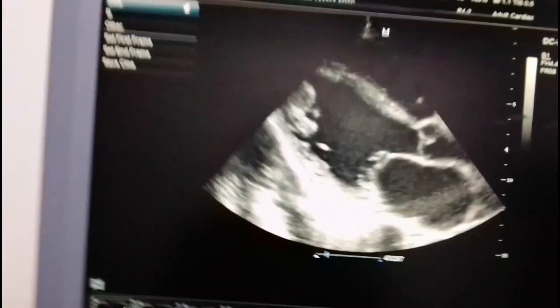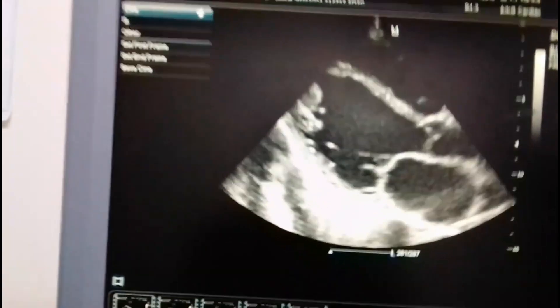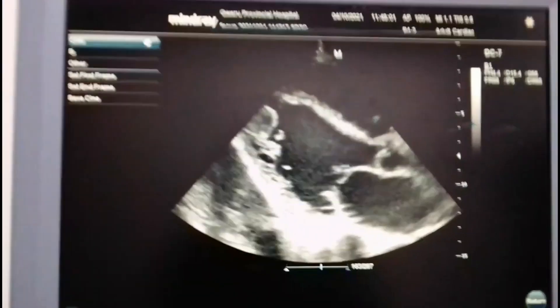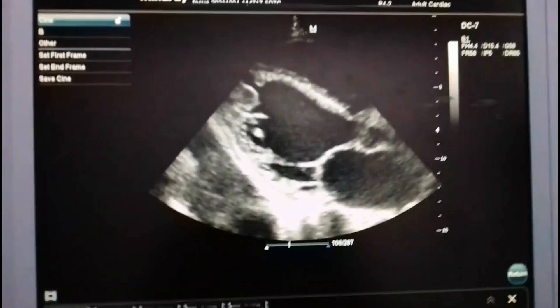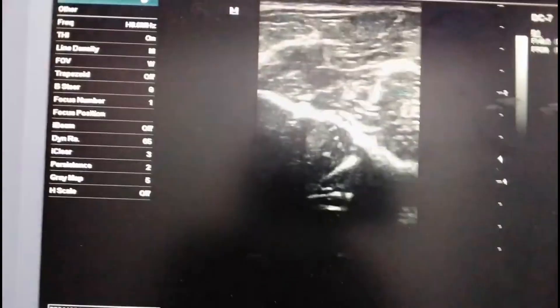Let us do a practical demonstration of how we actually use the focus key to advantage. We're going to use your arm as an example. This is a superficial scan. Place your probe there. You can see what is coming up on screen. The focus button on this machine is this one here — different machines have different buttons — and this is our focus button.